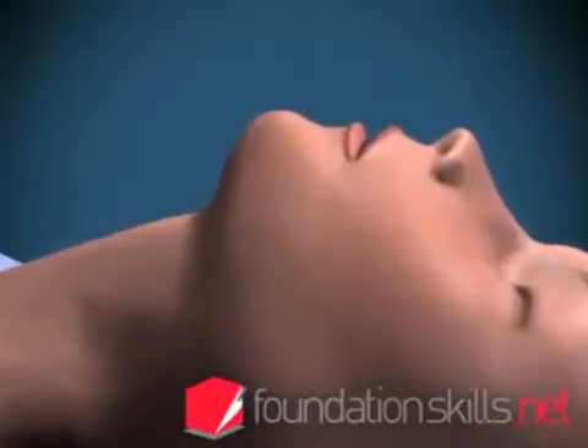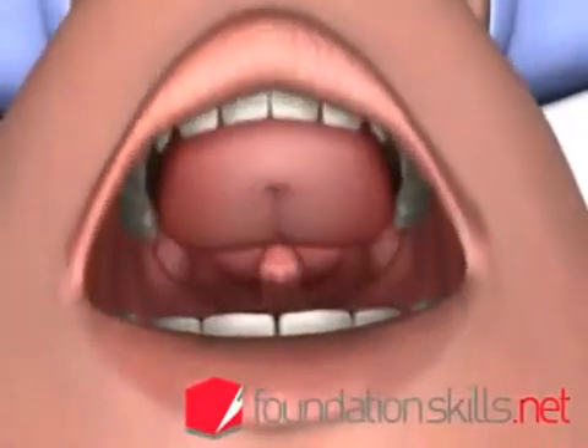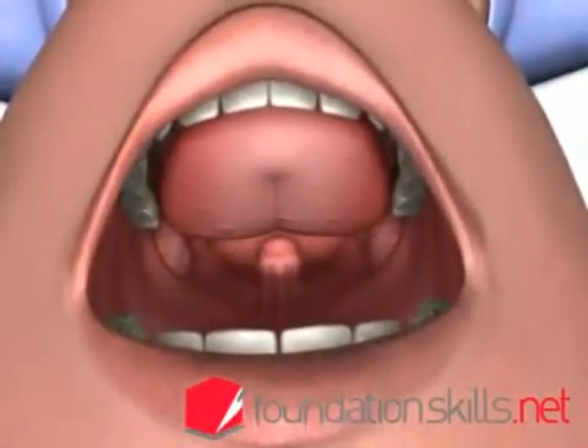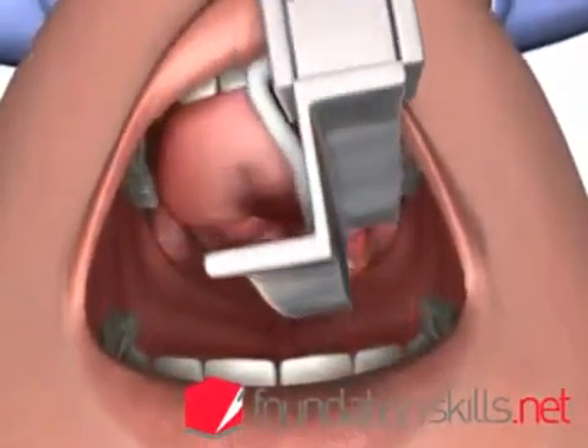Standing behind the patient with the head in the sniffing the morning air position, with the left hand, insert the curved blade of the laryngoscope into the mouth over the right side of the tongue, displacing it to the left and upwards.